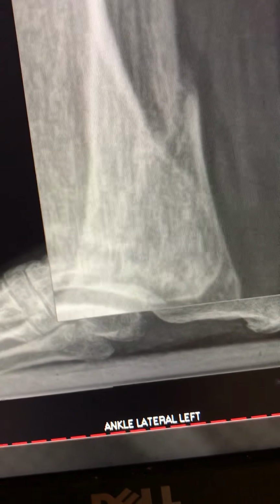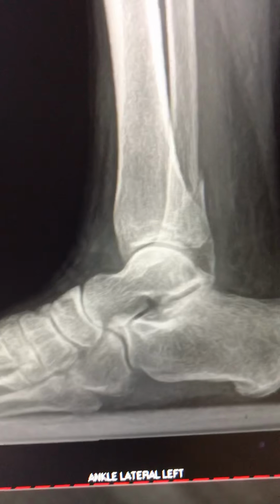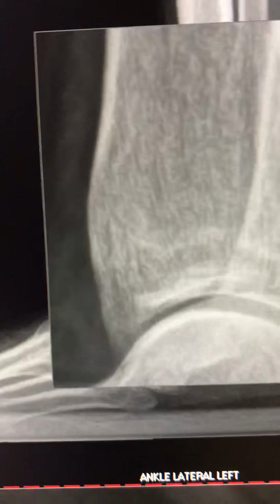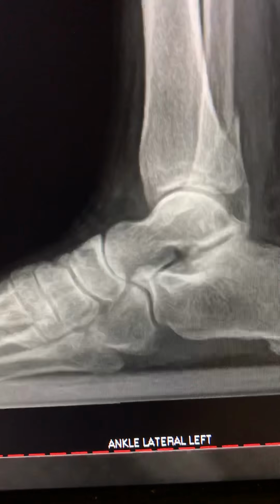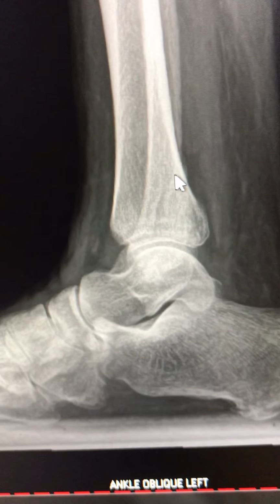So that's good. The back part of the tibia is healed. And let's look at all these structures, if we may. So looking at it from this angle, it doesn't look bad at all. As we saw, the joint is fine. Everything looks great. We're going to rotate furthermore. We can see the gapping is much, much tighter. We can see the back part of it consolidating and anchoring itself.